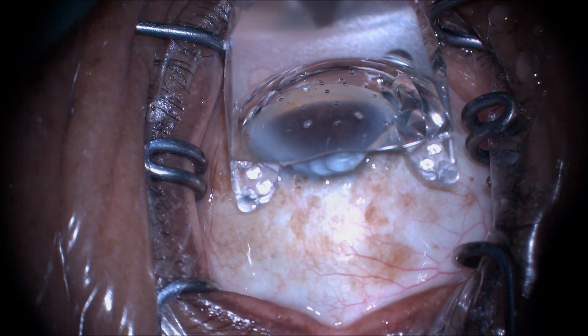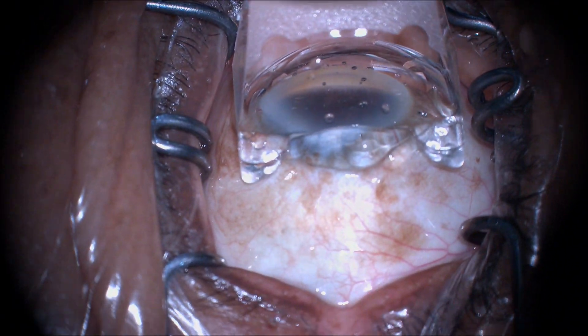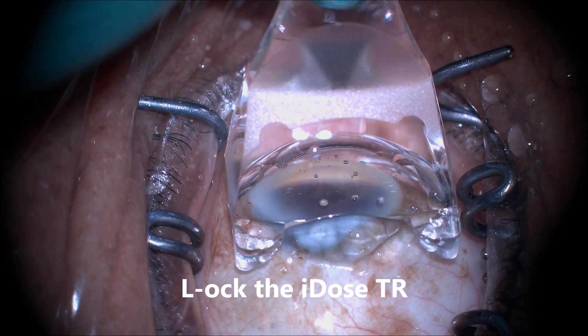This is a patient where the first two incisions have been made: the temporal clear cornea and the inferior paracentesis. The anterior chamber has been filled with Helon 5.